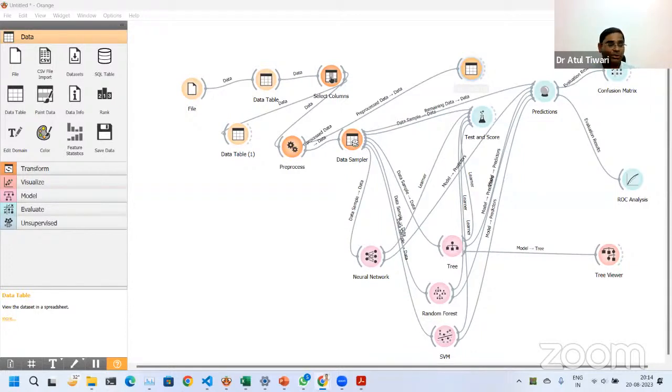Who should be the signing authority for these particular reports? He should have good knowledge. As I showed you, there are false positives and negatives in this simple data set. This was a very curated data set. Ideally, it can be as accurate as 99.1%. I have seen one piece of research where someone proposed a method by which this data set reaches 99.1% accuracy. So the technicians might not be aware of those kinds of things. For accuracy, he needs to understand how the nucleus looks under the microscope and how the AI algorithm is diagnosing. It would be difficult for him, but yes, if certain guidelines are not made clearly, then it would be very bad even for the patient, because then everybody will be taking out the printout for the whole slide.